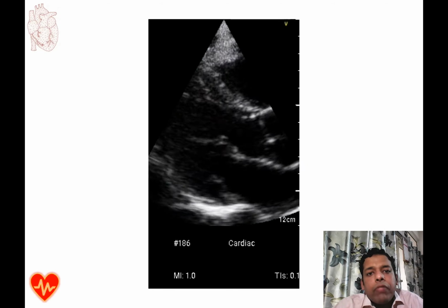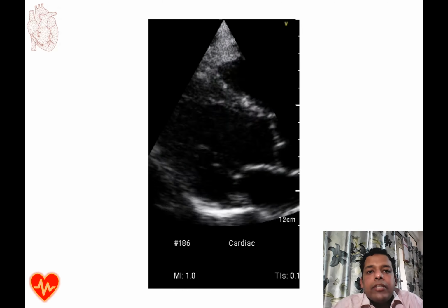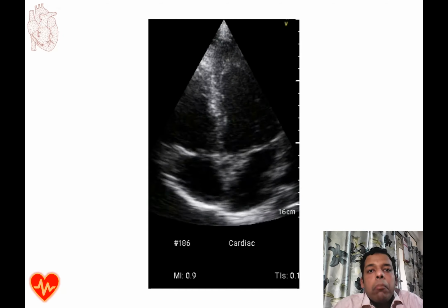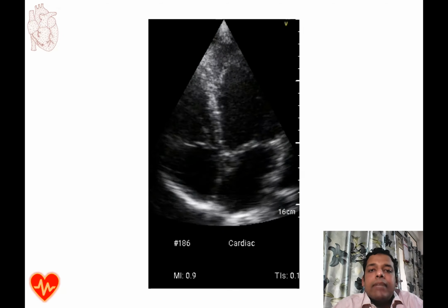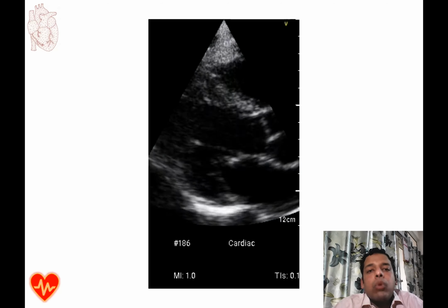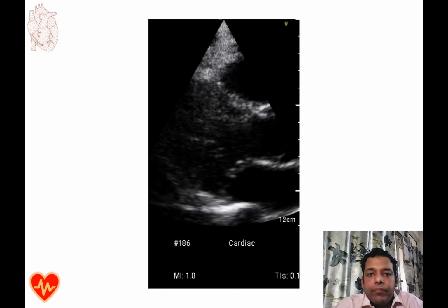A simple rule of thumb for cutoffs of the left ventricular internal diameter in diastole for males is more than 6 centimeters, suggesting mild dilation, and more than 7 centimeters, suggesting severe dilation.